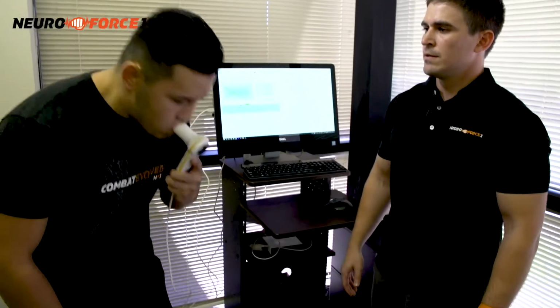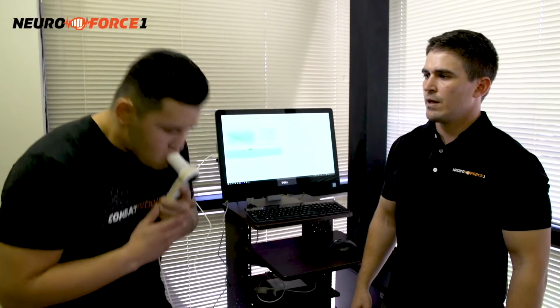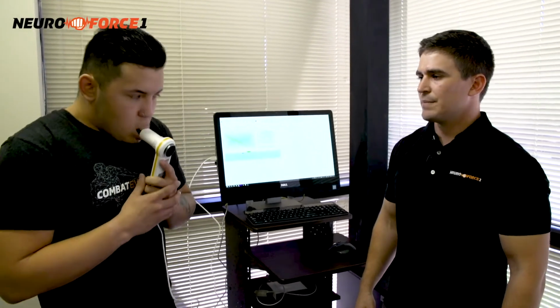strengthening these inspiratory muscles. All right, Santana, we're going to have you perform a quick 12-second maximum voluntary ventilation. Whenever you're ready, go for it. And stop. Good job.